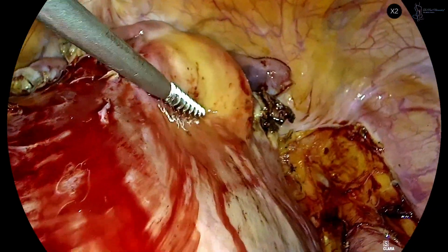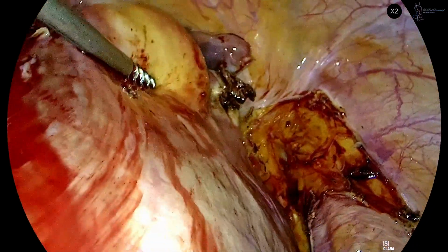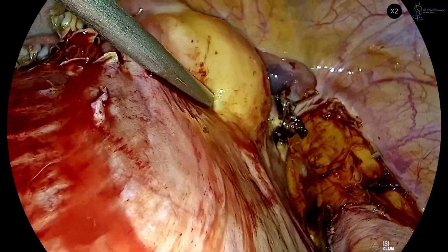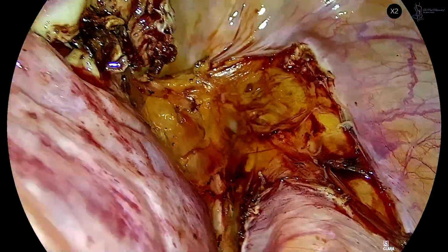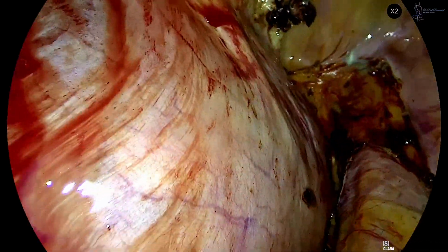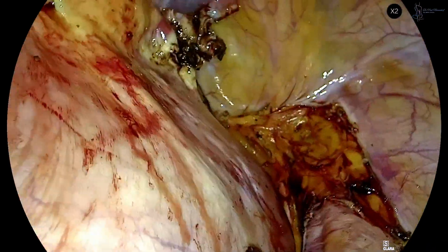The myoma screw is now being utilized to provide traction, allowing for better visualization. This maneuver enhances exposure, facilitating a more precise assessment of the surrounding structures and aiding in the surgical approach.